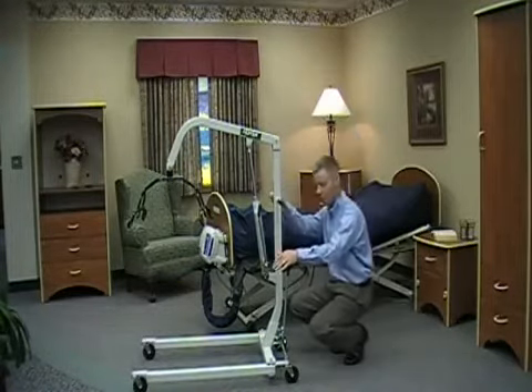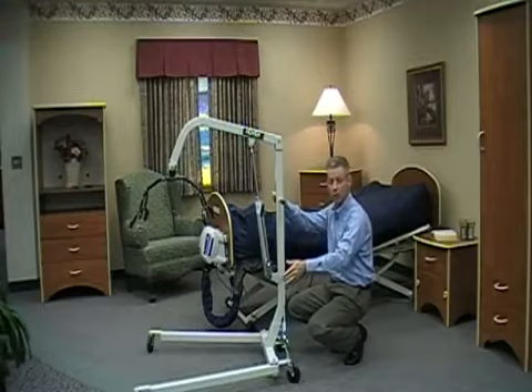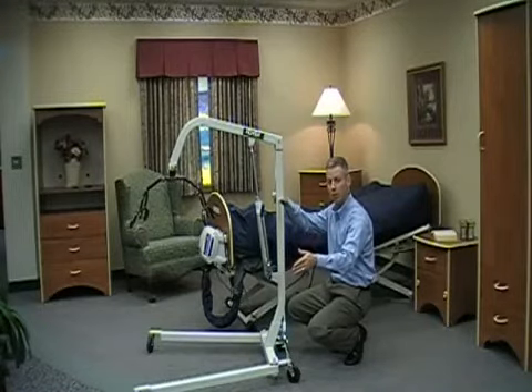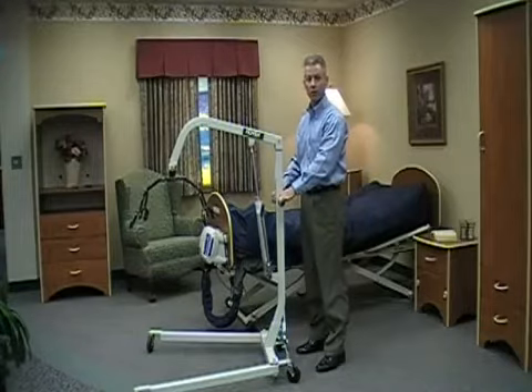There's a spreader bar at the back. The spreader bar is designed to open the base so that you can get around larger objects such as chairs, wheelchairs, or anything that may be in the way. We also recommend that you open the base for any lifts or transfers that you're going to complete, and we do not recommend that you use the HML 400 as a transportation device.